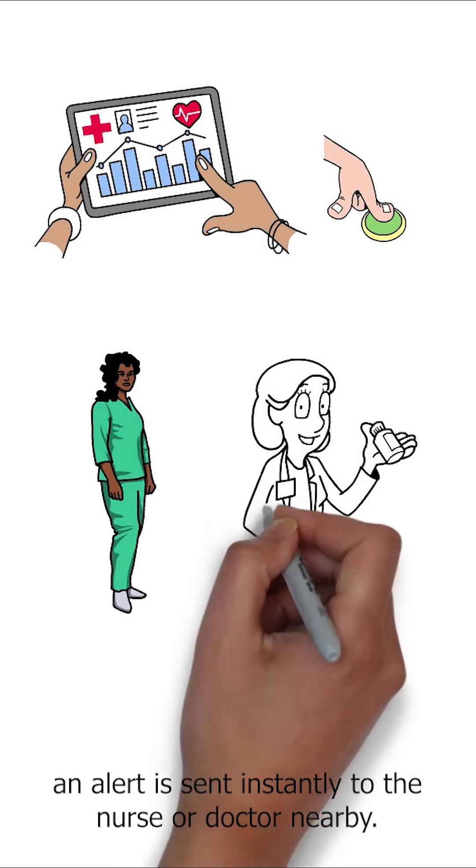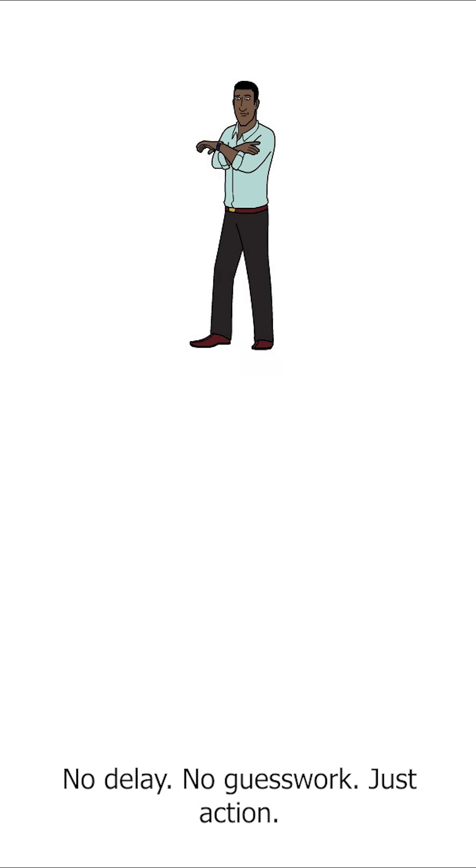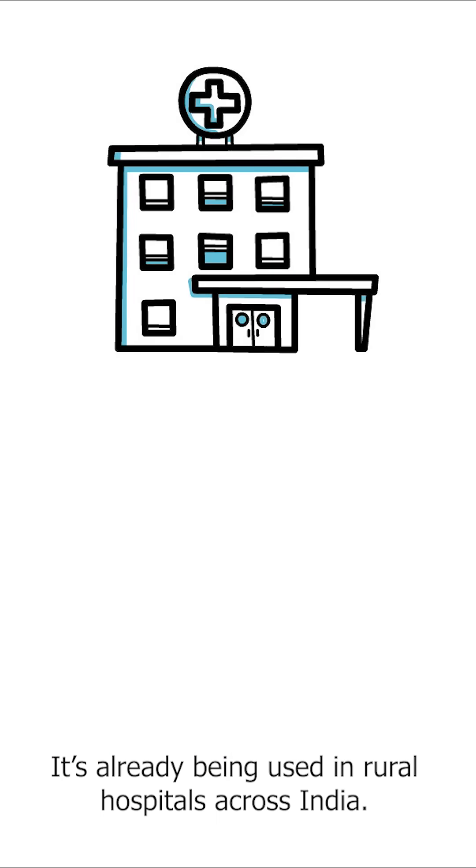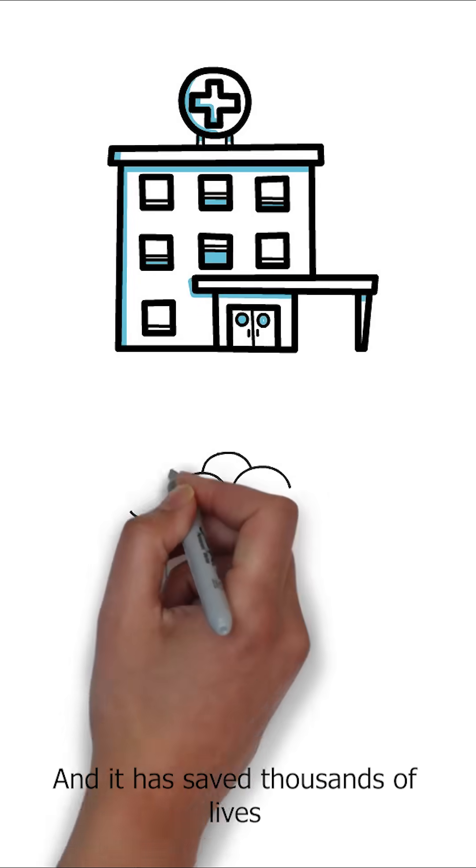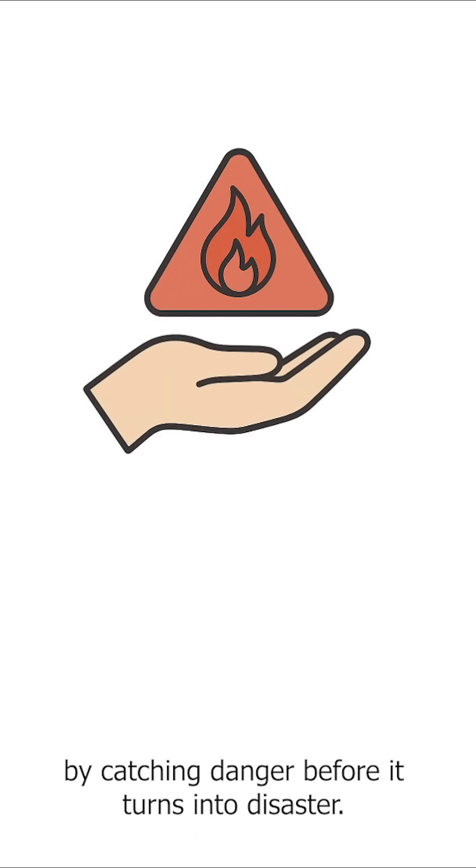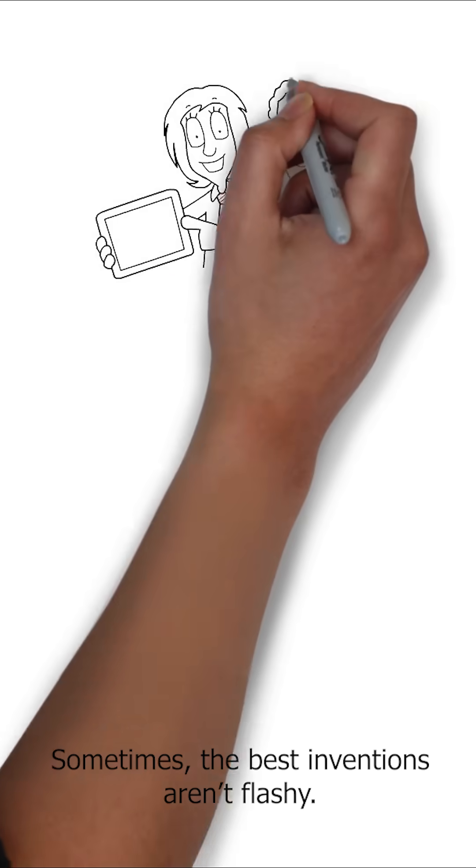No delay, no guesswork, just action. It's already being used in rural hospitals across India and has saved thousands of lives by catching danger before it turns into disaster.